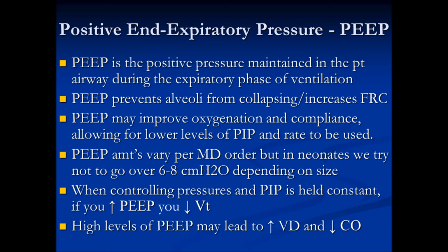Okay, so the PEEP amounts vary per MD order, but in neonates, we try not to go over 6 to 8 centimeters of water, depending on the size of the neonate. The smaller the neonate, surprisingly, you can go higher on the PEEPs. You would think, because they're so little, that we're concerned about barotrauma, but you're really not.